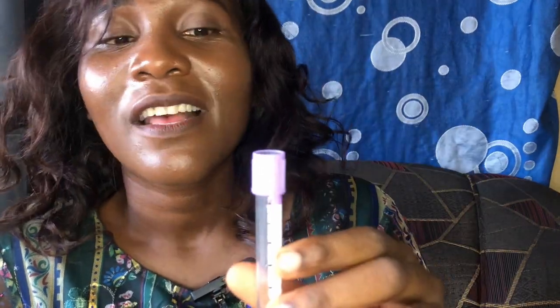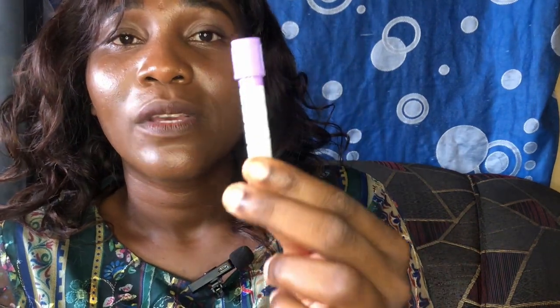It is an anticoagulant. It helps to retain the cell morphologies in your hematological samples. When you place your sample into this tube, it will retain the cell morphologies.